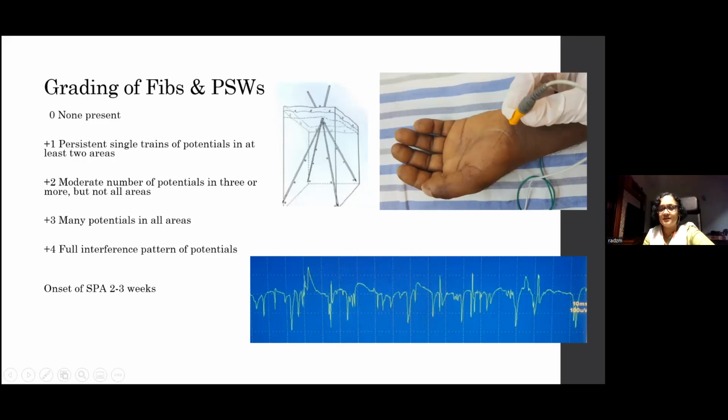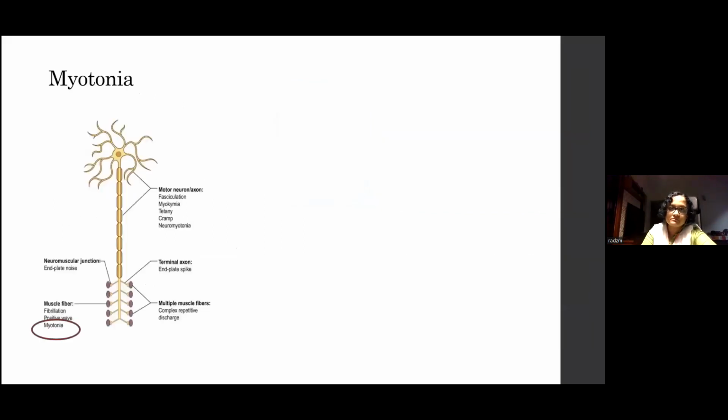This picture here is an EMG of the abductor pollicis brevis. So you put the needle in and you just gently look at 4 quadrants, by not taking it out from the skin, but just moving it gently in 4 directions.